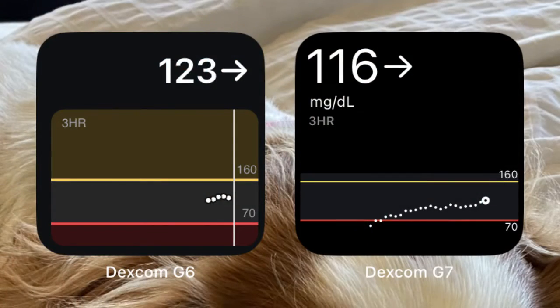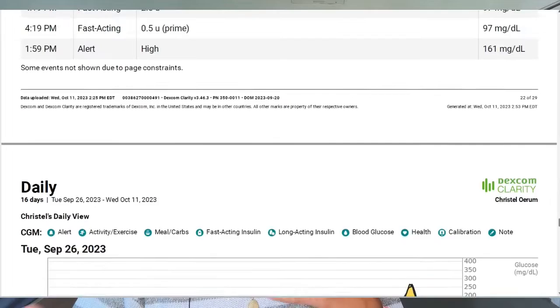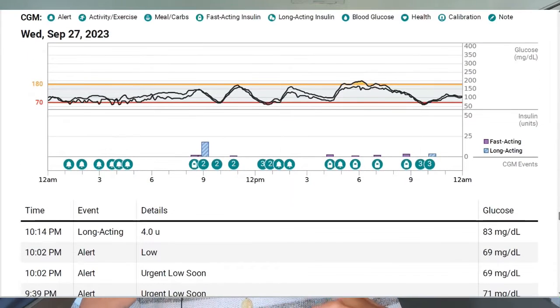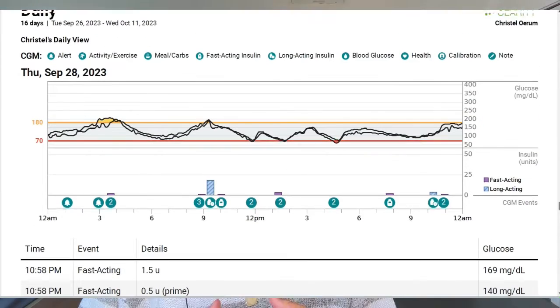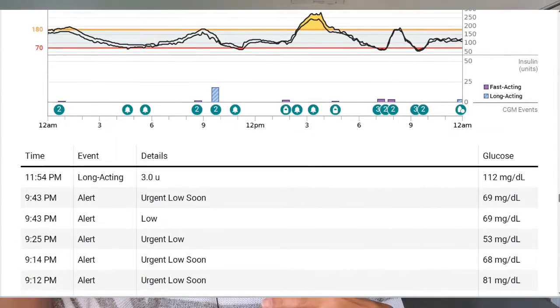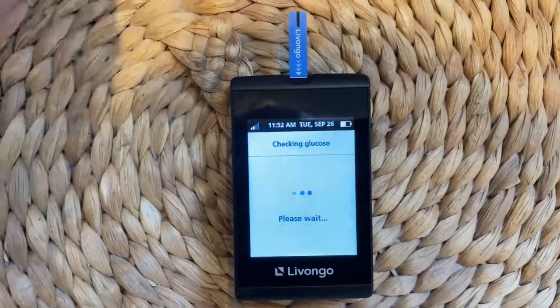Overall I did not see a huge difference between the Dexcom G6 and the Dexcom G7 data, but they weren't giving me the same readings either. In Clarity, the Dexcom reporting software, it pulled in both readings — G6 and G7 — so you can see the overlay, and look how close they were on a daily basis. That's pretty cool, but sometimes one sensor would claim a high blood sugar while the other would say you're in range, which didn't build up a whole lot of trust in either sensor. On average, my G7 was giving me slightly higher readings than my Dexcom G6 — the average difference was only 8 mg/dL.